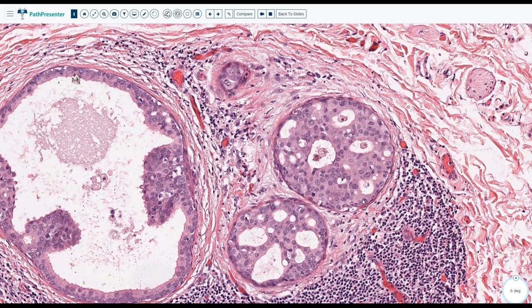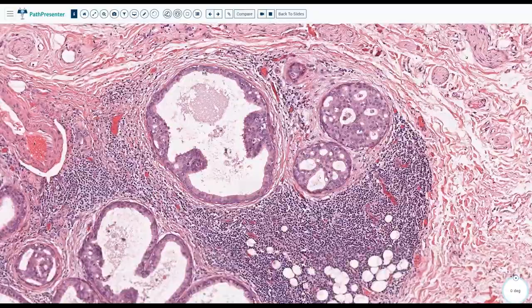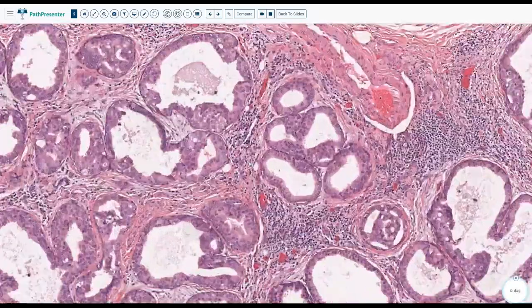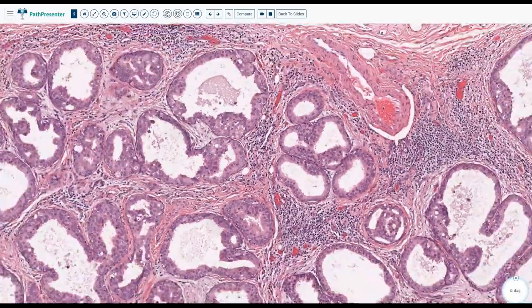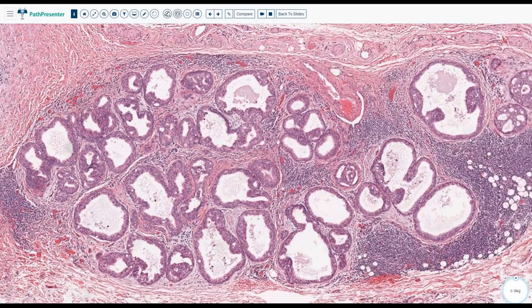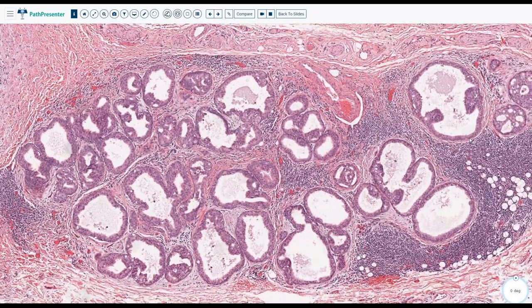Okay, and that is actually a different discussion, DCIS versus ADH. Maybe one time we'll discuss it. So you have this. It looks like ductal carcinoma in situ, and once you have this buzzword, you are talking about salivary duct carcinoma.